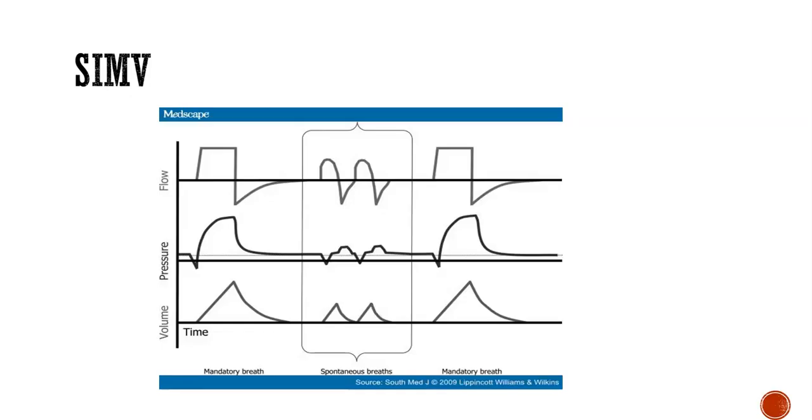Okay, so this is an example of what SIMV looks like. The patient receives periodic positive pressure breaths from the ventilator at a set rate and a preset volume. The patient can breathe unassisted and spontaneously without any additional volume needed. When a patient is able to breathe spontaneously, spontaneous efforts will be synchronized with the timing of the mandatory vent breaths and coordinated that way.